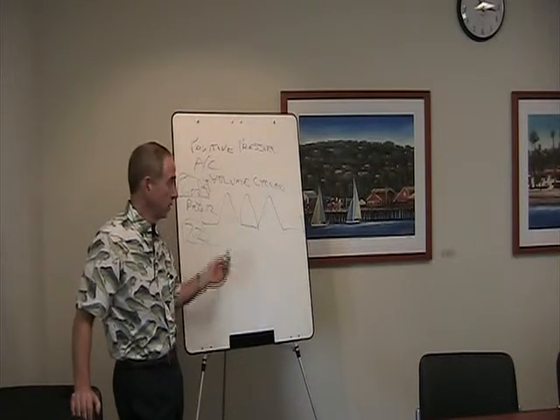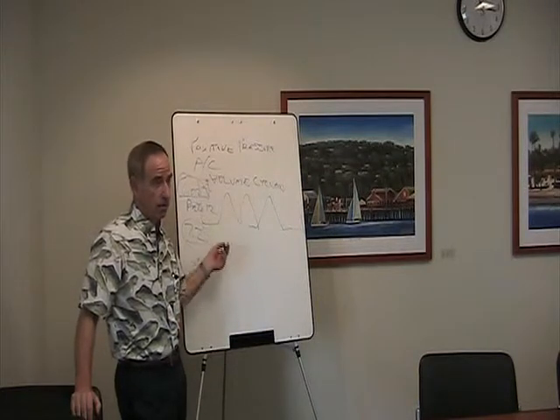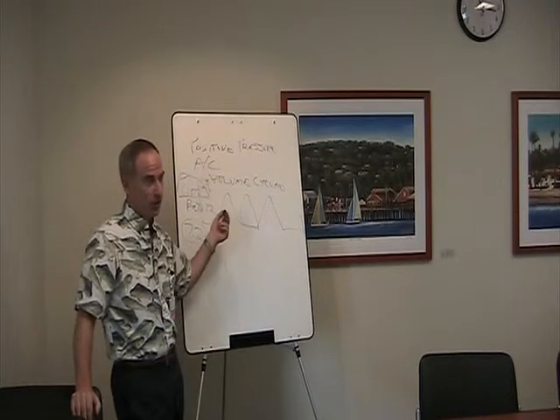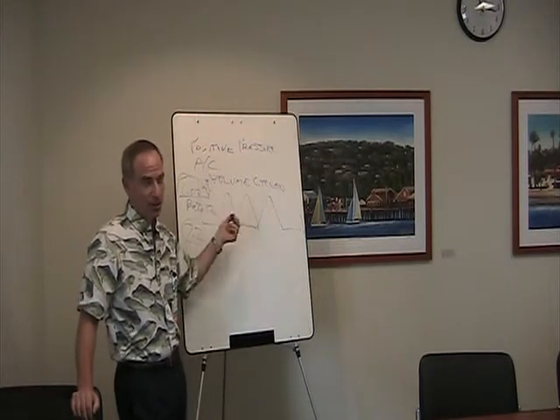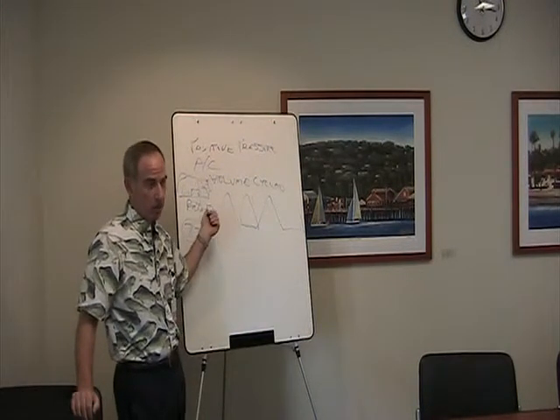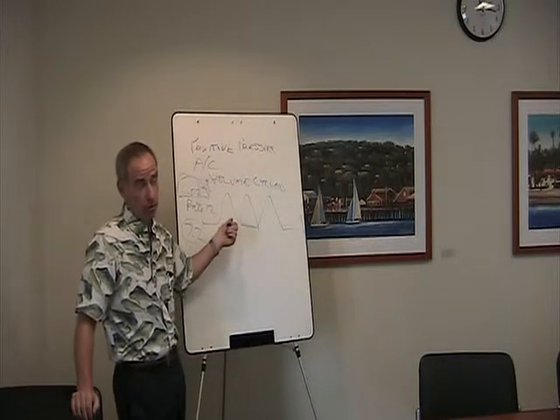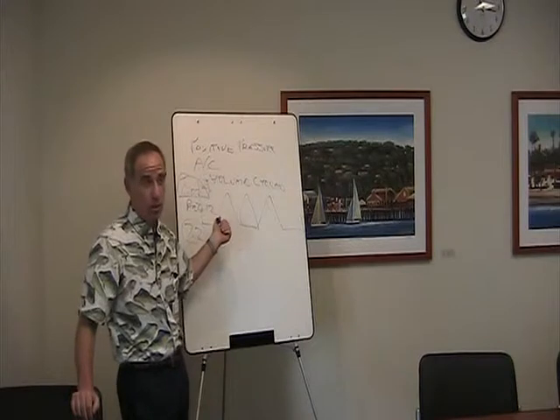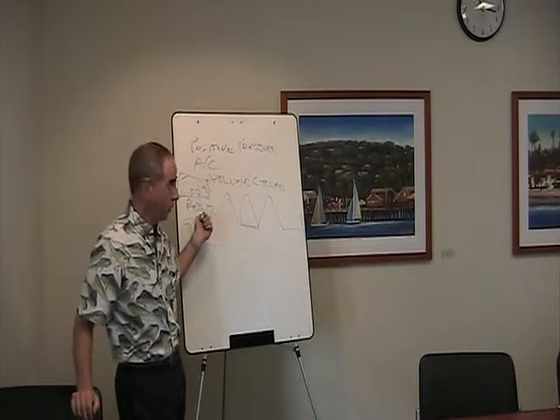Well, what does decreasing the set rate do? Actually, that won't do anything, because they'll still be able to take spontaneous breaths. A common medical student or intern mistake in the beginning of the year is to decrease the rate to try and decrease the ventilation. If you're in this mode of ventilation, it doesn't matter. If they're breathing 30, they're going to get 30 full breaths a minute, even if you've set it to 2. So decreasing the rate will not help.